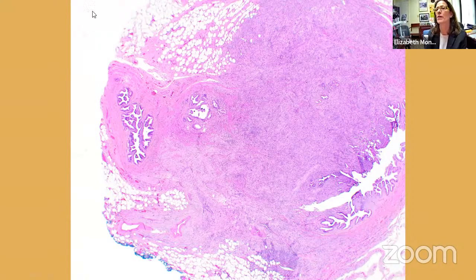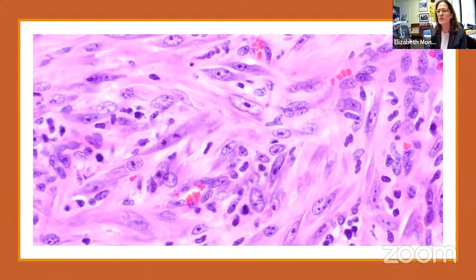It's the gallbladder, but it probably started out here and then worked its way into the muscularis propria. And then, of course, the gallbladder has no submucosa, so it's even present in the mucosa. So pretty cute case. So this is how inflammatory myofibroblastic tumor looks at high magnification.